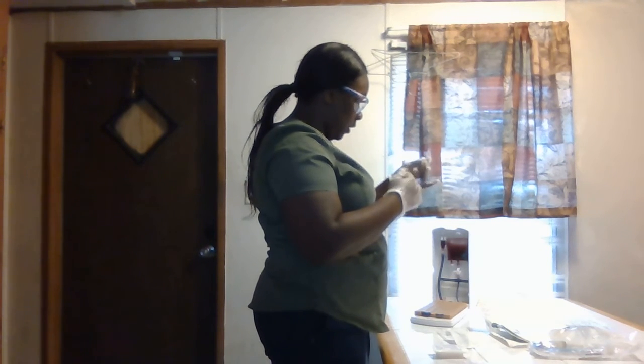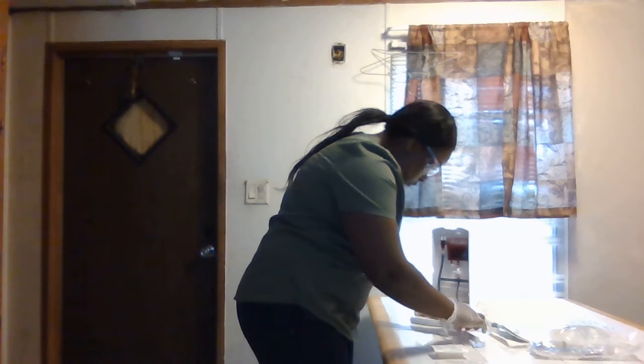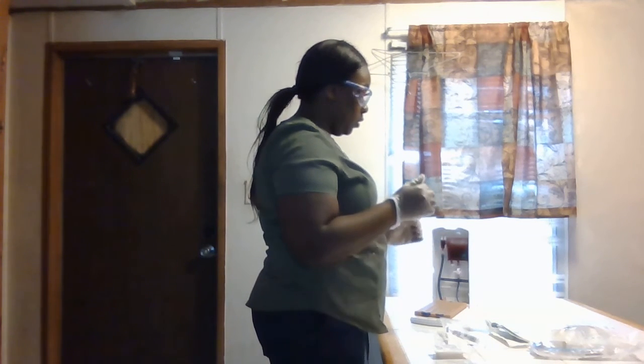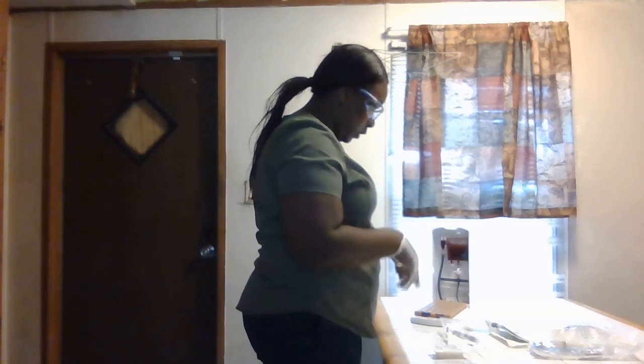Okay, and I have saline at the end of the cap. And we can go ahead, I'm going to place it back down here, and we can go ahead and loosen up our top. Again, leaving the top on because we want it to remain sterile. Again, never crossing over our sterile field, always maintaining sterility. Okay, so loosen up my clamp. So now I can go ahead and, yep, I'm about ready.